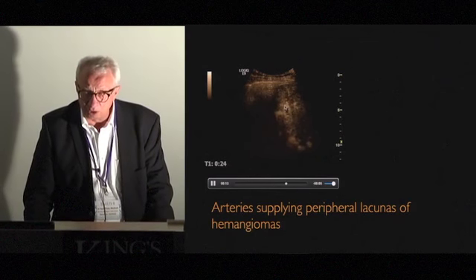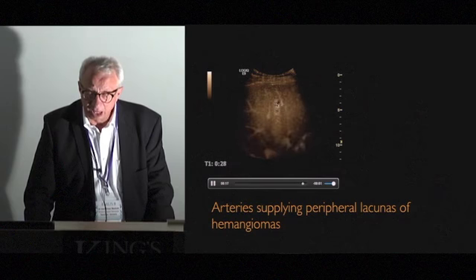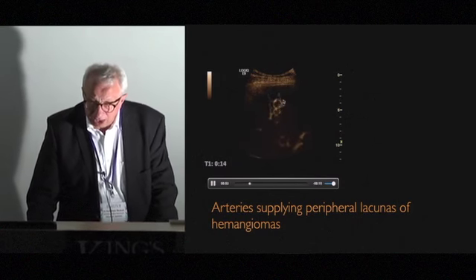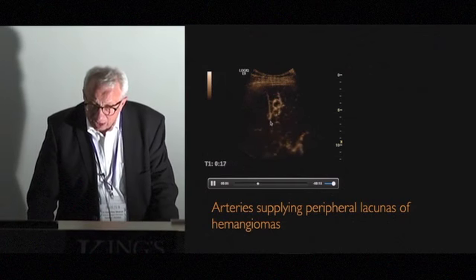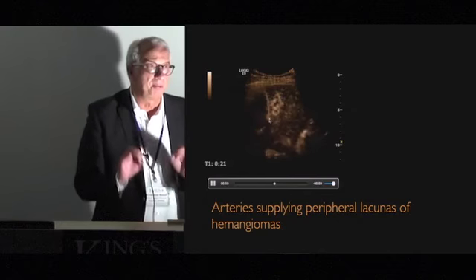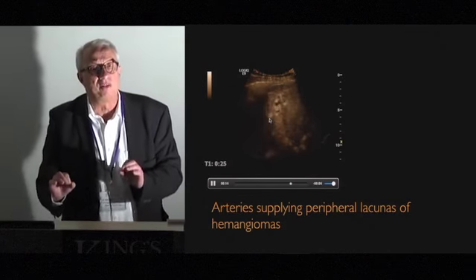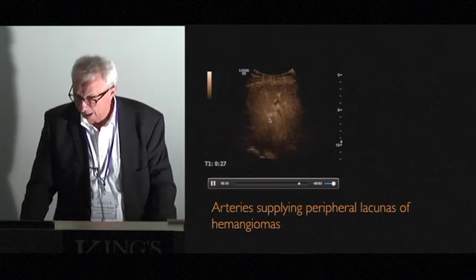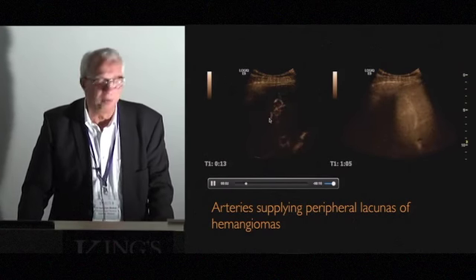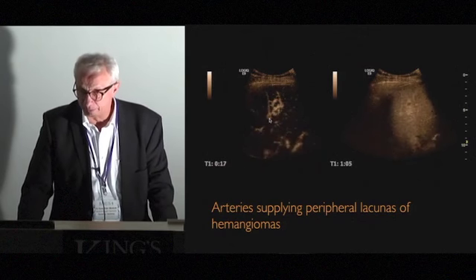Here are the small nodules that are filled with blood and contrast. If the loop is running again, you can see this is the artery. So you see the enhancement only in the artery. There's no portal vein. Now the portal vein is coming. So hemangiomas are supplied by arteries, and the best modality to see and demonstrate that is contrast-enhanced ultrasound. And of course, if you wait a little bit longer, you can see the hemangiomas are nearly completely filled. This is after 1 minute, so this is not the challenge.